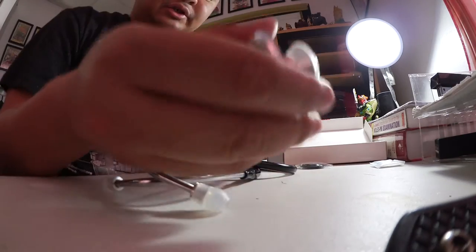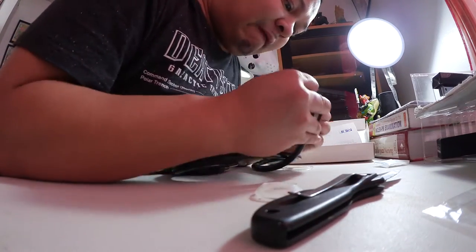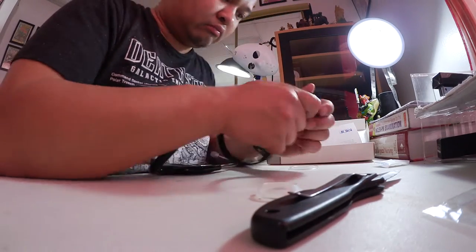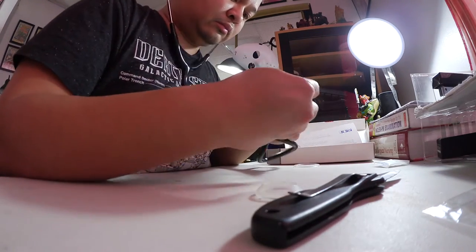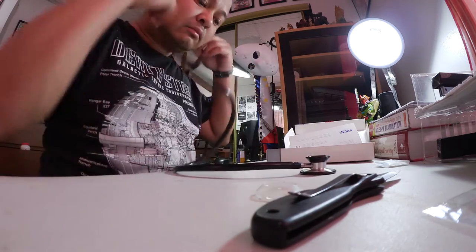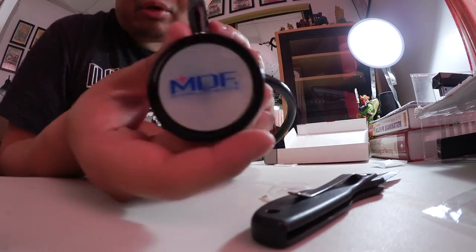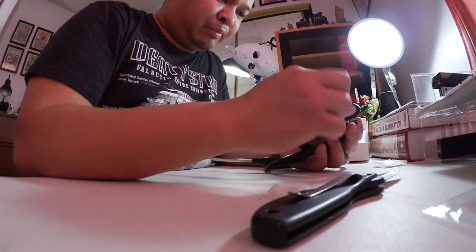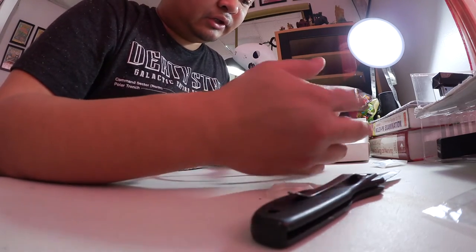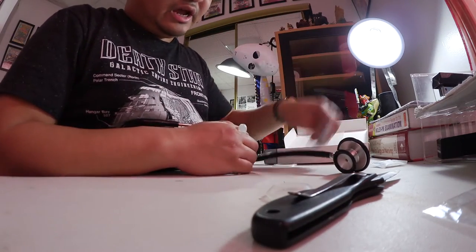So let's see if I can change this right now. Hopefully I don't break nothing. Let's see. So I'm gonna change this silver thing to a black one. Lesson learned when you're installing it, have it pointing outwards. It's better off putting the piece on top of the diaphragm and actually sliding it over. It has a little wrinkle, but it still works perfectly. Plus I have a spare and I have a lifetime warranty, so it doesn't even really matter.